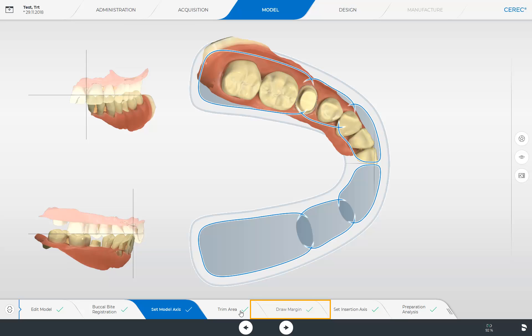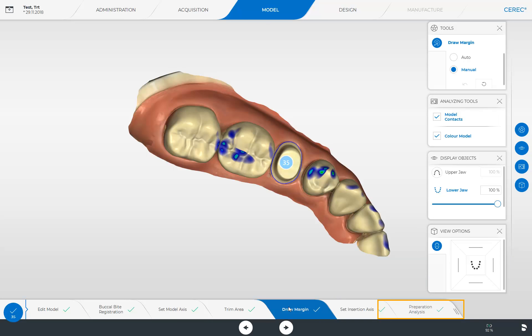We return to the Draw Margin step and briefly elaborate on the last step of the Step menu. You can use the preparation analysis to check the distance to the antagonist, identify possible undercuts, and check the condition of the preparation margin as well as the surface before the initial design proposal is calculated. Should any critical area be displayed here, it is recommended to manipulate the prepped tooth once again and scan the respective image catalog again.